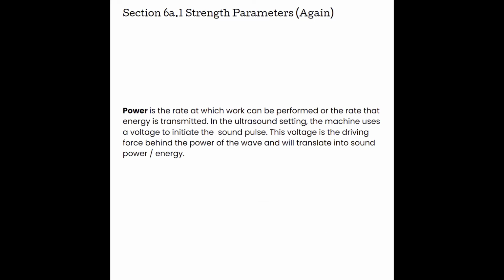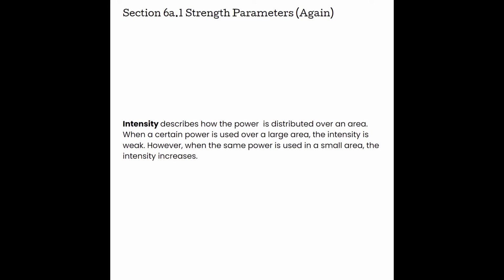In all applications of physics, power is described as the rate at which work can be performed or the rate that energy is transmitted. In the ultrasound setting, the machine uses a voltage to initiate the sound pulse. This voltage is the driving force behind the power of the wave and will translate into sound power or energy. Intensity then describes how the power is distributed over an area. If we have a set power used over a large area, the intensity is weak. However, when that same power is used in a small area, the intensity will increase.